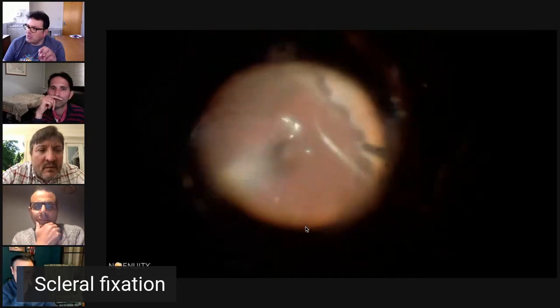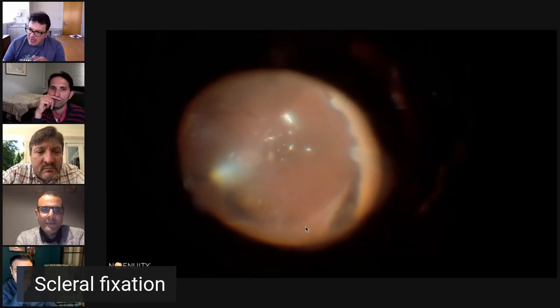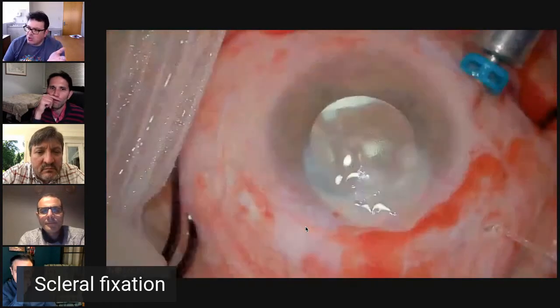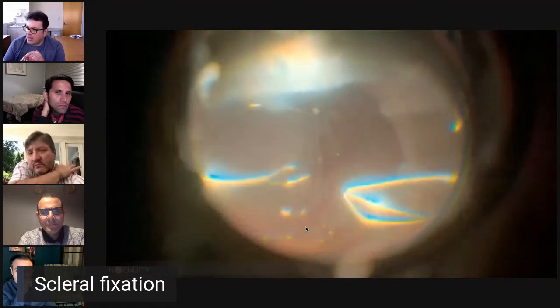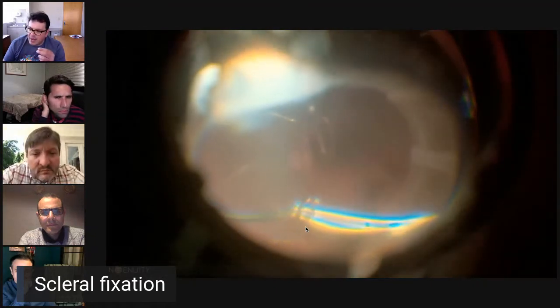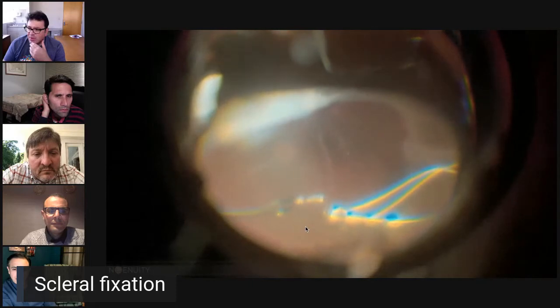This is here just to show a case where a patient had the Acrysof lens, had a retinal detachment, and during his vitrectomy surgery, the suture got cut. So that's how to secure it. I go here, and it's easier to do this outside a trocar, without a trocar, and I'm actually feeding the haptic through with the forceps. If you do this, it's much easier to do it without a trocar.